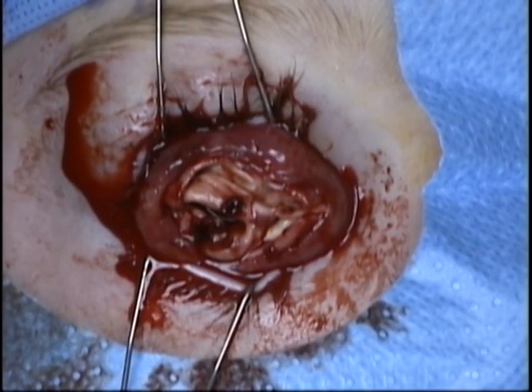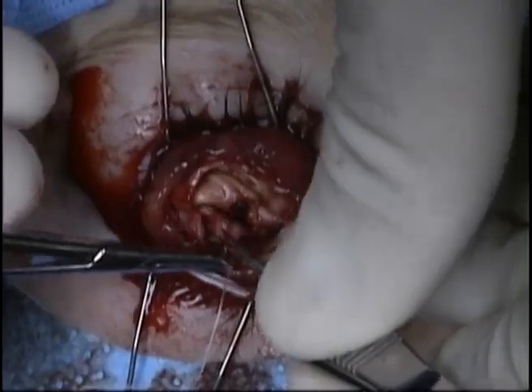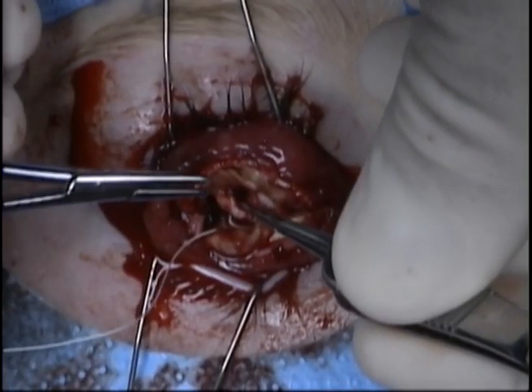The placement of the implant was not captured in this video, unfortunately. Usually, I prefer an 18 or 20 mm PMMA implant.